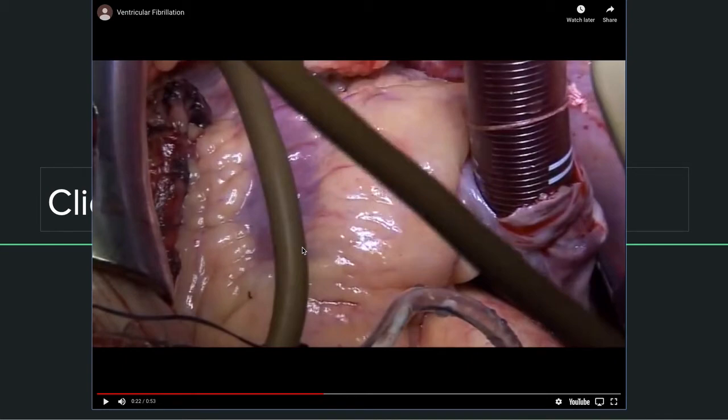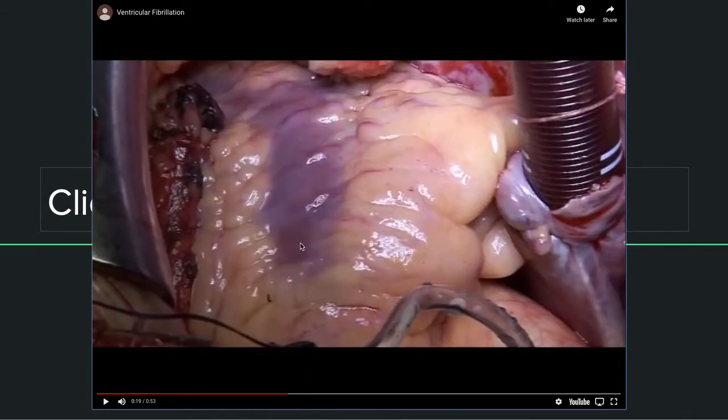What they're going to do now here in a second is defibrillate. You've probably seen those automatic defibrillators throughout campus and at hospitals and all over the place. And basically what they're going to do is shock the muscle at once, basically. Try to depolarize all the cells in the heart so that hopefully once they've shocked them all at the same time, the SA node will take over again. So let's see what happens when they shock.